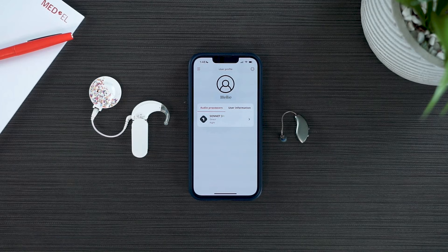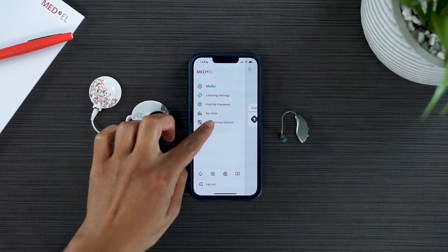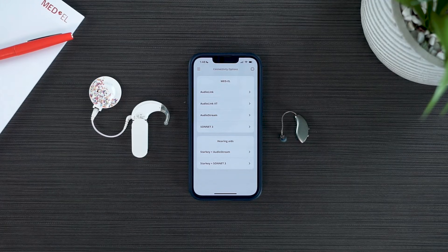With your hearing aid connected to your mobile device, we can now sync it with your Med-El audio processor. Open the Audio Key app, select the Menu button in the upper left, and select Connectivity Options. Under Hearing Aids, select the combination that applies to you.